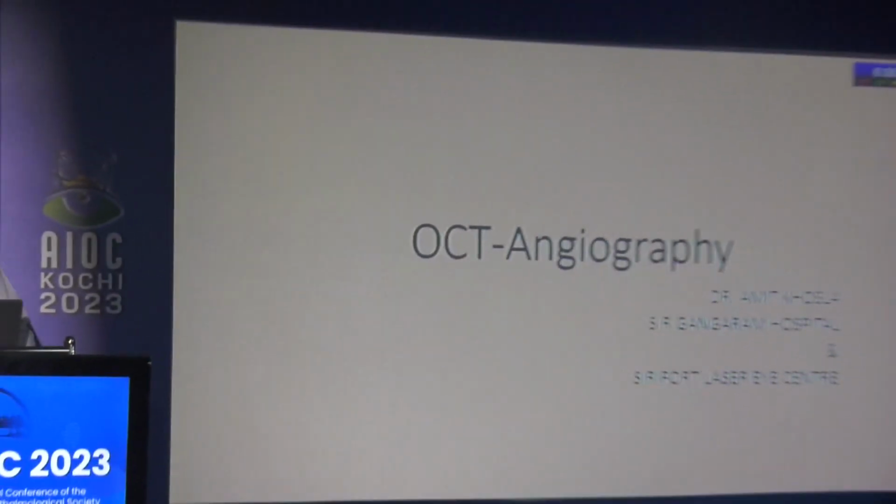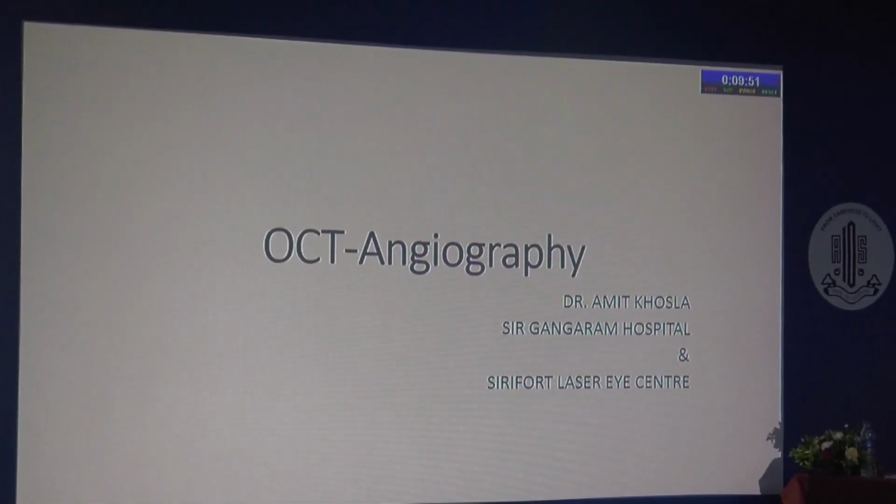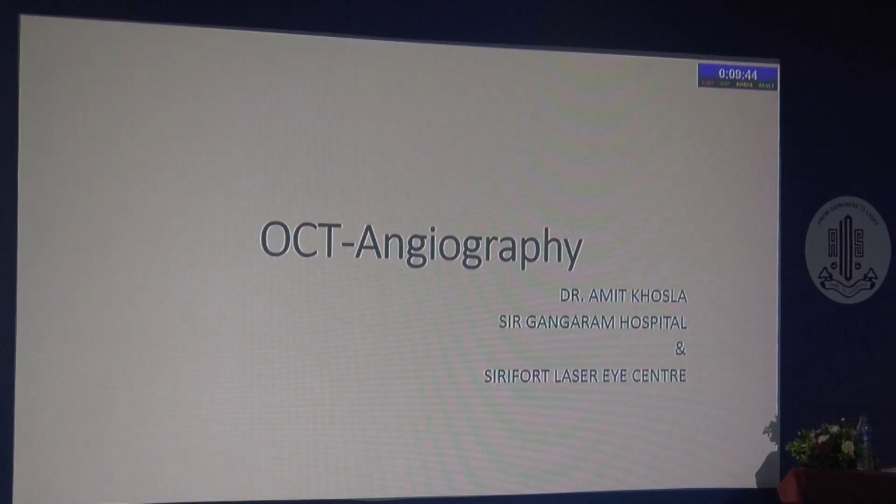So what I would recommend is, when you see an OCT, just some tips: you see 4 things. Even if you don't know how to read OCT, just think of 4 things. Number 1, what is the normal contour? Is it too dipped, is it thin, or is it elevated, as in ERM?